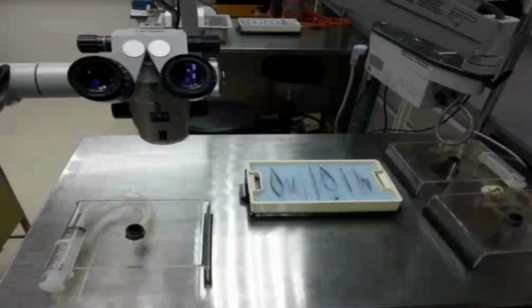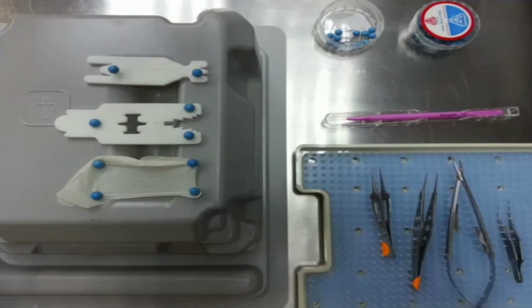So the next step after suturing is done. Suturing is basically the safest, but suture comes with a price as well. Most of the time, we have a lot of suture there that is either expired already or donated by the company. So you can always utilize that until it is all finished. Then only we look for a way to get a new suture.